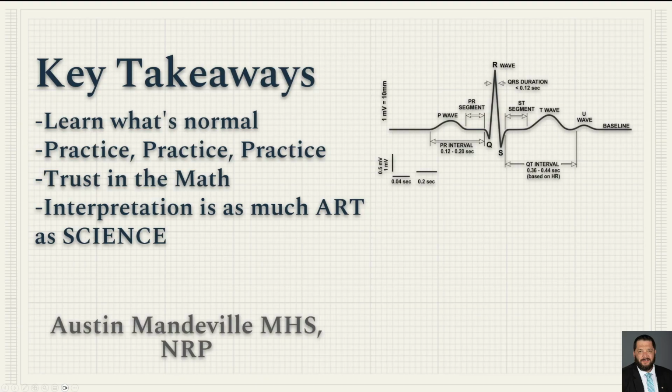Learn what's normal. Focus on this image, learn the normal approaches, because every dysrhythmia you will learn is simply a deviation from normal. Trust the math and learn the numbers. And remember, just as we mentioned in the last lecture in this series, interpretation is as much art as science, and practice will go a long way in helping you hone your art and apply the science to this process.